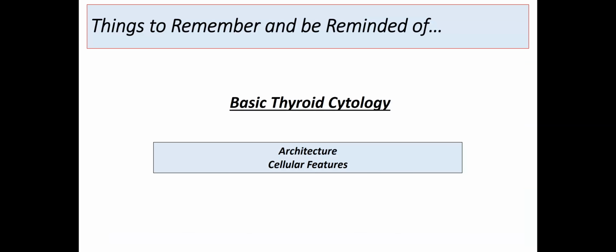Now let's go to the fun part of my talk, and that is what really is the matching of the thyroid cytology to the ultrasound findings and to the histology. And I think this really is important because we do have to correlate what we call on cytology with the histologic follow-up, because it's a learning experience as well as a QC and QA exercise.